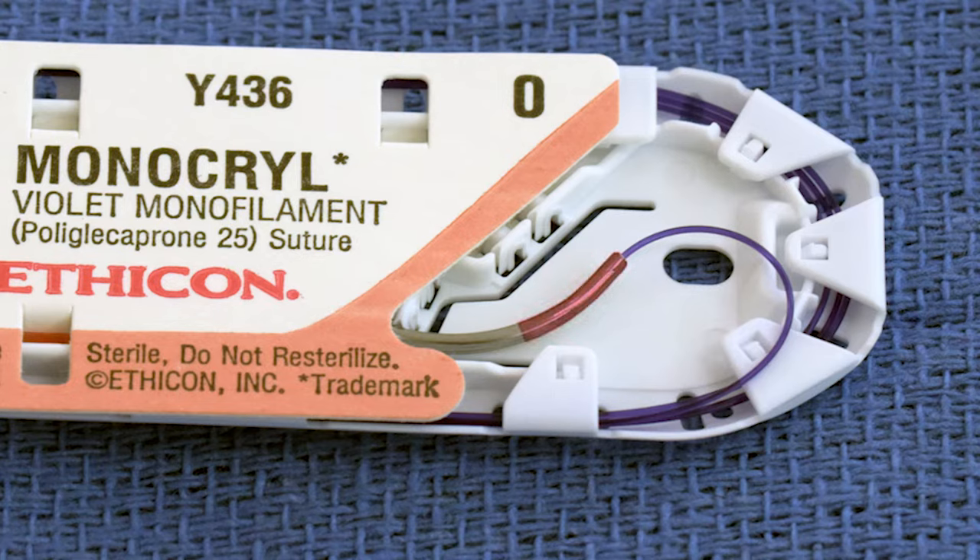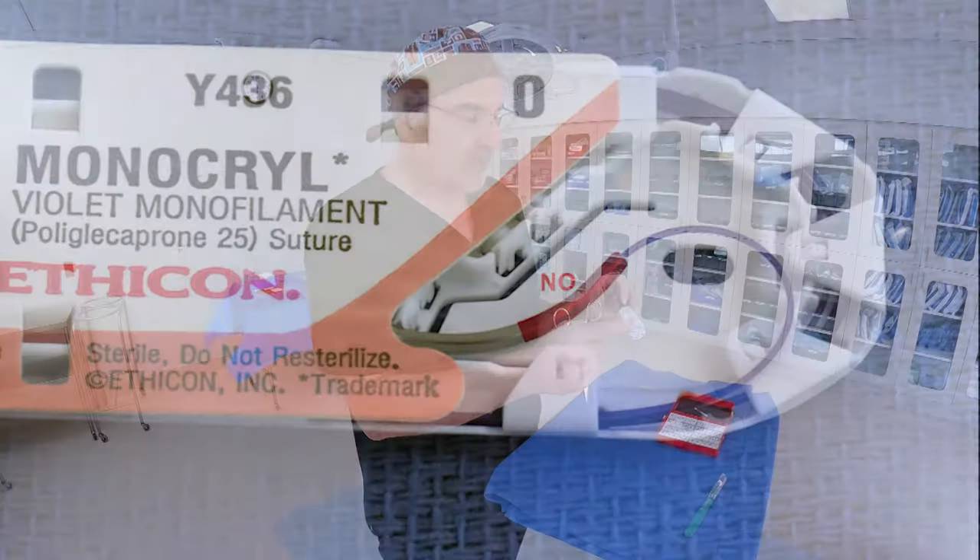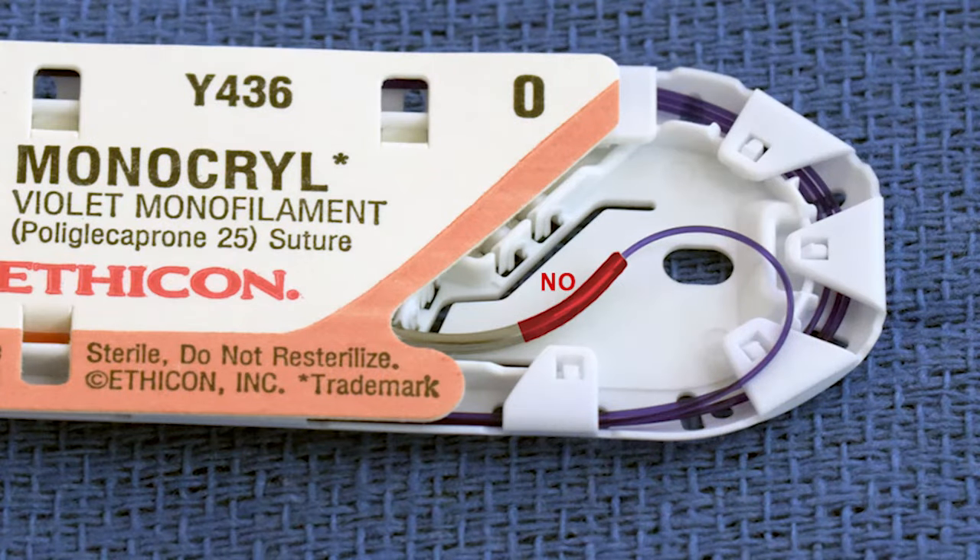That back edge is called the swedge, or the swedged end of the suture needle. That's the area we want to avoid because we don't want to mess up that clamping that holds the suture. So we're going to grab the needle at about one-quarter to one-third of the way around. Since half the needle is visible and half is hidden under the paper, the halfway point is right here, and one-quarter would be about halfway through that — right about there. Anywhere in that area is a good place to grab the needle with the needle driver.